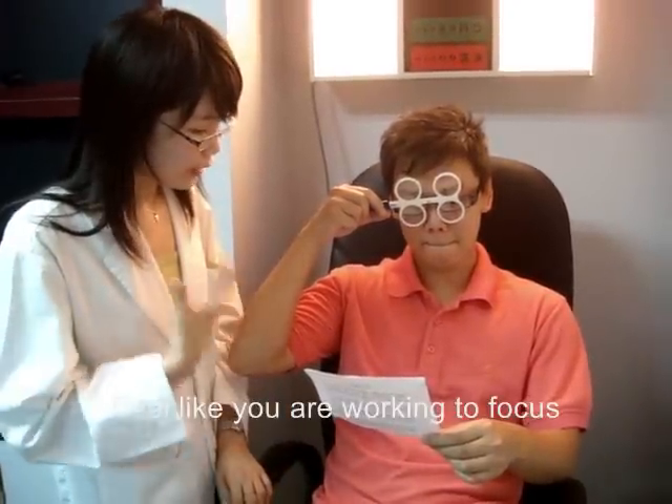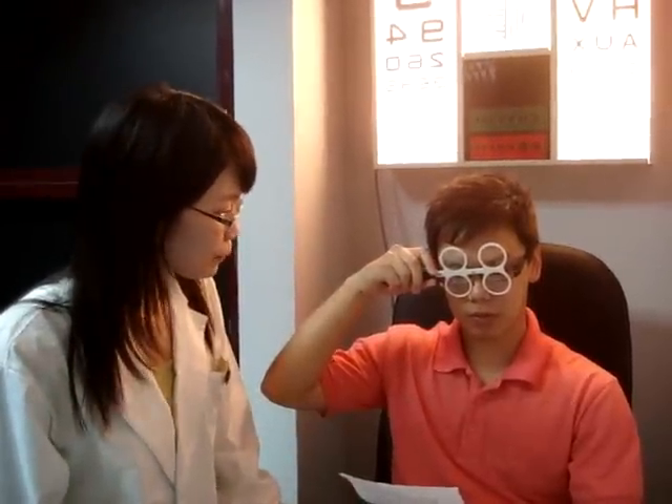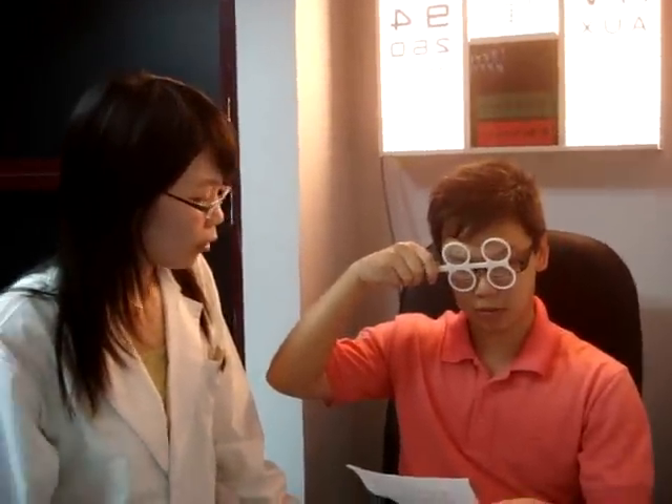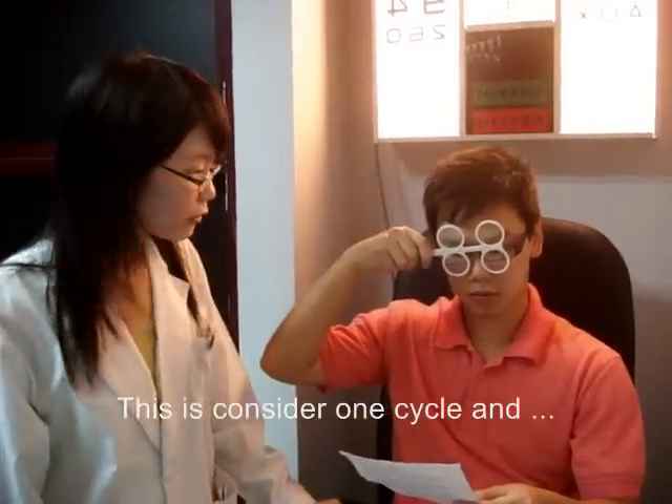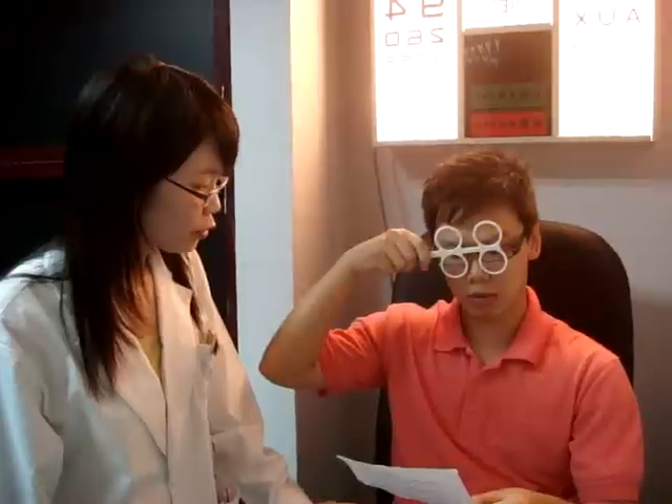Do you feel like you are working to focus? Well done, Derek. Now I want you to flip back to the plus lenses. This is considered one cycle, and I want you to repeat this for 15 cycles. Try your best to clear the line as fast as you can.